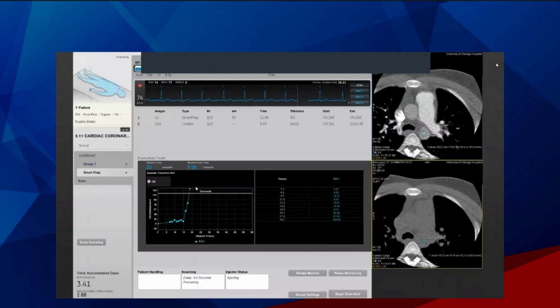Here's an example of the coronary scans that we've done. You see the nice even waveforms here, nice high R peak, smaller T peak. Your resting phase here is ideal for the scanner to actually pick up when to scan. So this is destined probably to be a good scan. Note the nice even waveforms here.